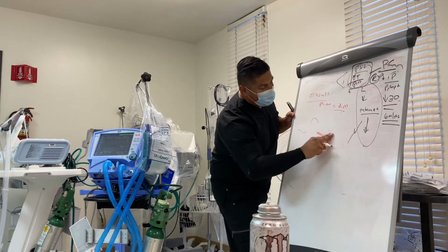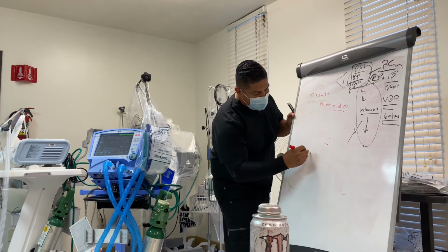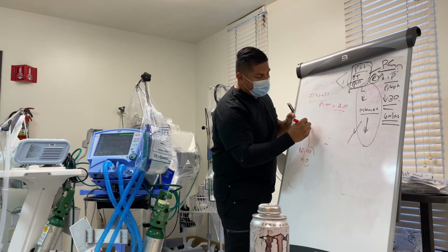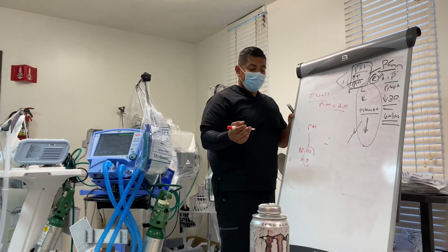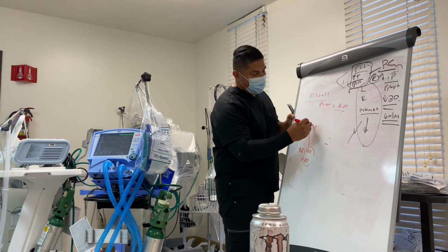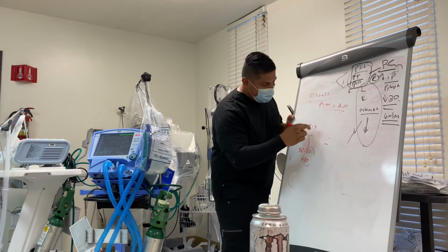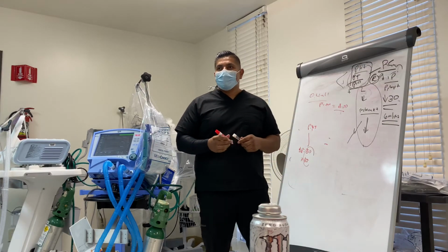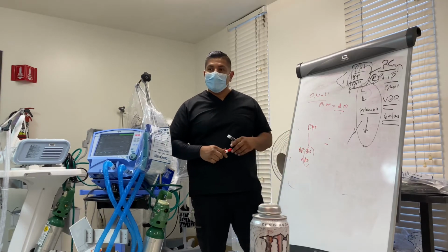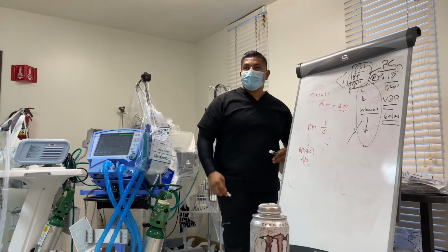if my delta pressure is 20 and my PEEP is 5, effectively my PIP is 25, right? Which is cool, no problem. But what if my patient's not oxygenating right now? It's 15. All right, now you're at 35. But what if my tidal volumes are low? All right, so now you're in damage area. Exactly. This is why you have to know how to adequately adjust your tidal volume and know which demon you're going to fight.